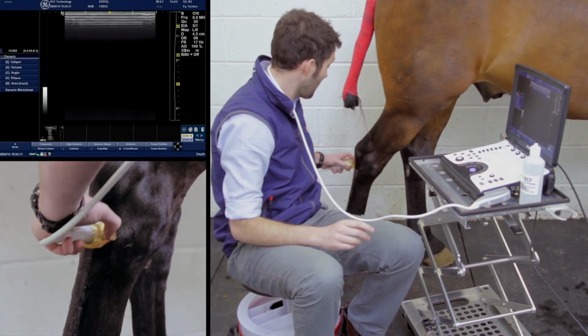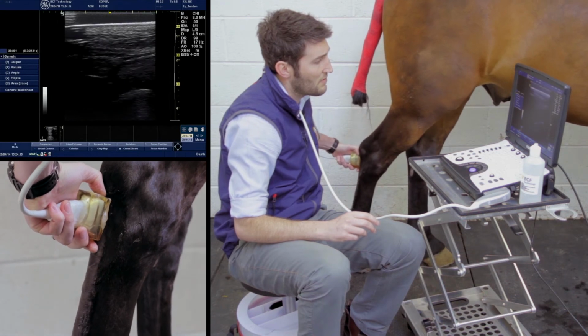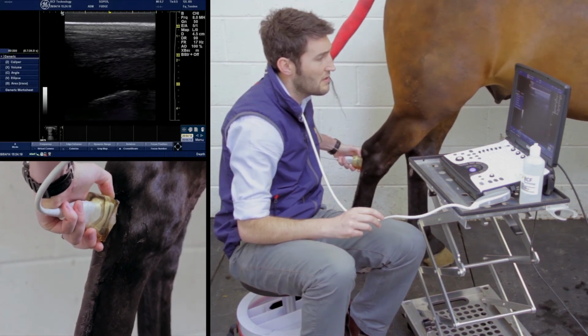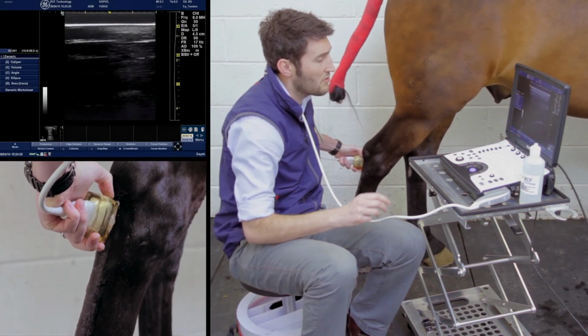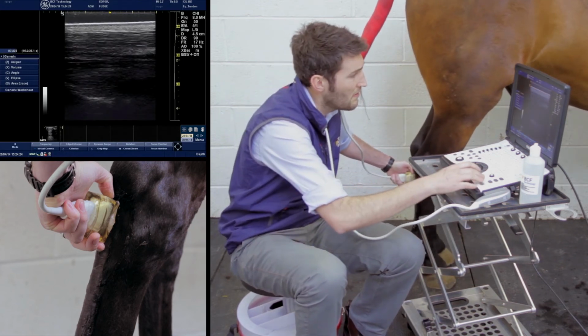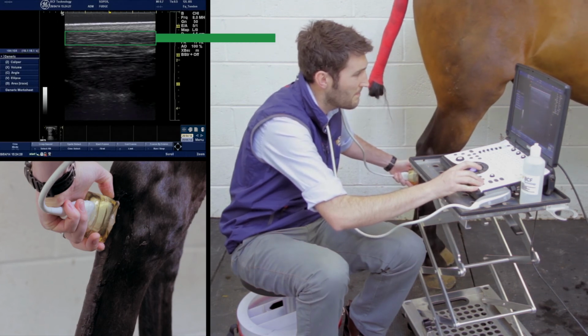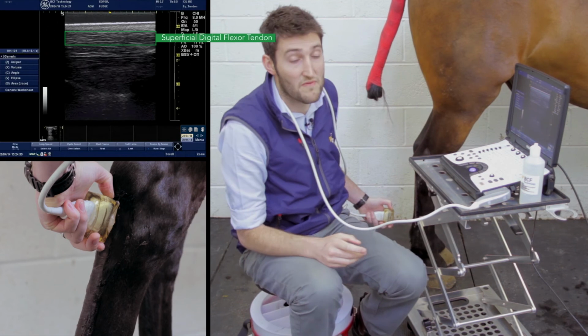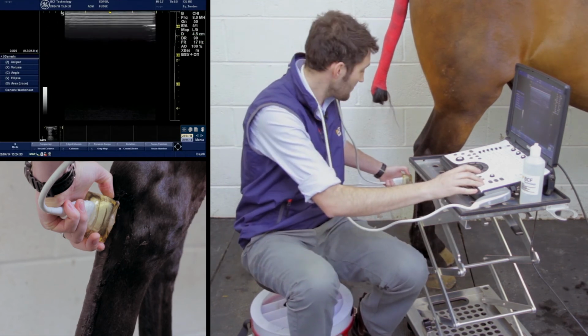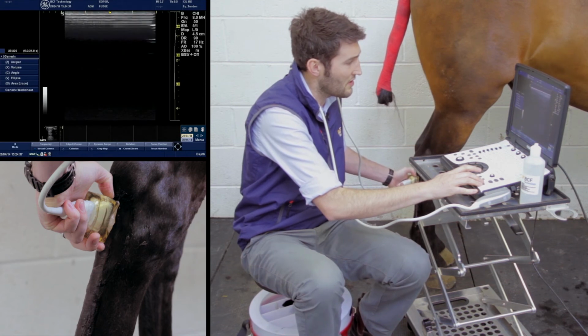We can also have a look at those structures in longitudinal section. So again, on the midline, optimise our image. We can have our superficial digital flexor tendon, coming laterally.